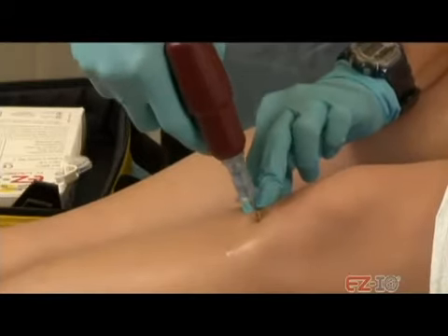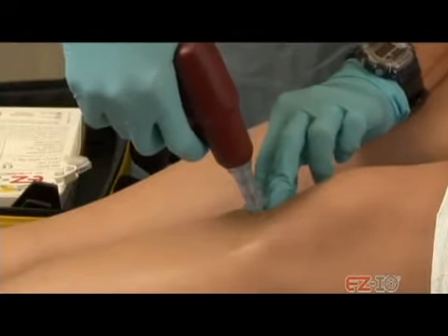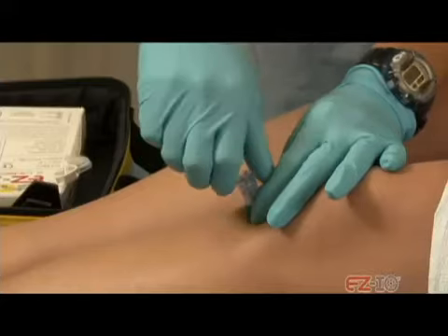Okay, quick poke. Ready? 1, 2, 3. Okay. How was that? That's all right. Doing okay? Mm-hmm.